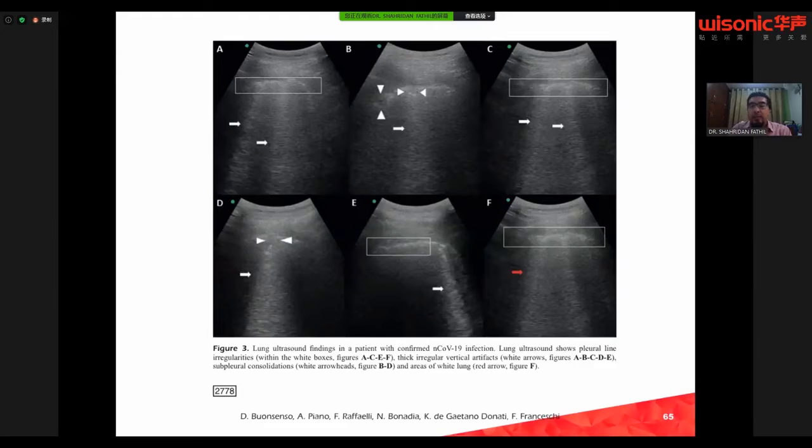And in some instances, lung ultrasound can replace the CT scan, particularly if patients are very unstable or on high settings, and where bringing the patient down to the CT scan room may be detrimental to the patient.